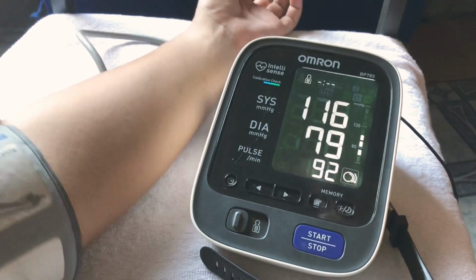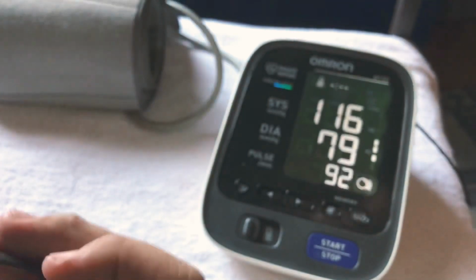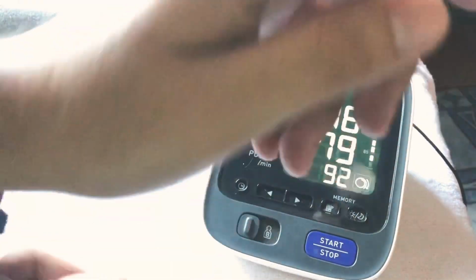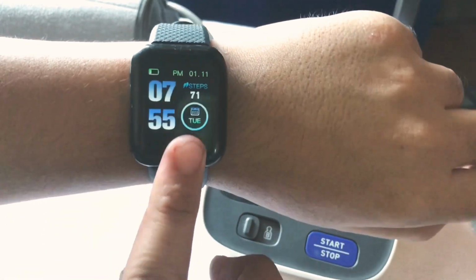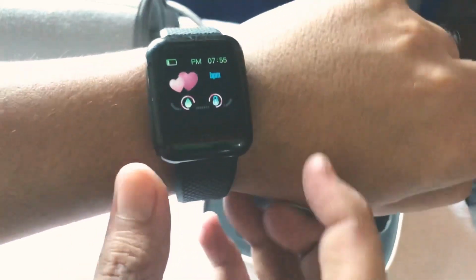Okay, so now we're going to wear our 116 Plus smartwatch, and let's try to check if the result is close to the real result. Again guys, I'm not really telling you to use this smartwatch if you have any illness. This is just a comparison. Alright, so I already wear our 116 Plus smartwatch, and let's try to test it with its blood pressure feature. So let's just long press it here. Okay, and as you can see, the sensor is already lighting, so let's wait.